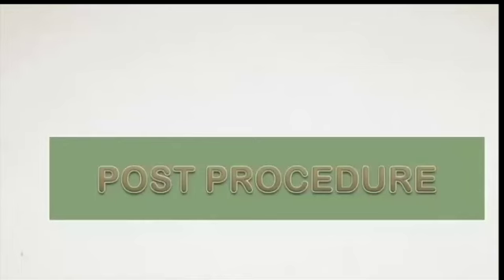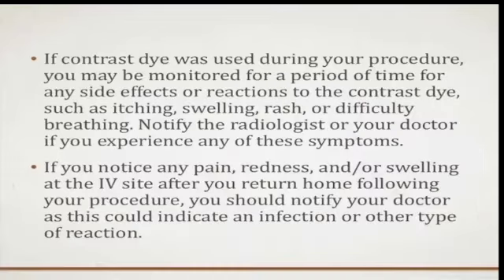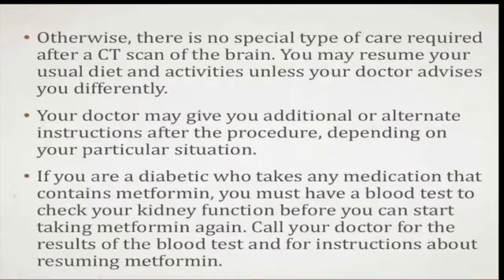So by now, I think it's proper that we should discuss some noteworthy events after a CT imaging procedure. After using a contrast dye, we should keep an eye out for some side effects of pseudoallergy, such as itching, swelling, rash, shortness of breath. Also, any infection at the site of injection should warrant medical attention. So we always ask the patients to give us a call if they notice anything weird after they've gone home.